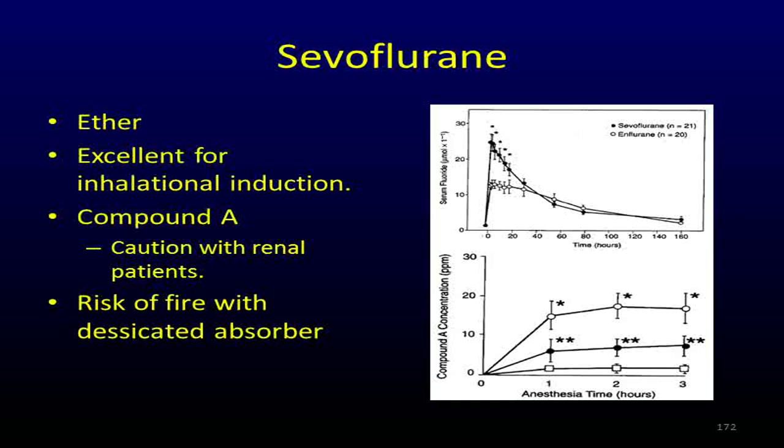Yes? I understand the combination with sevoflurane. How is it getting to patients? Because you breathe it in, so it's a close contact. You're using a semi-open or semi-closed system, because what you don't know yet is that the pressure valve on your circuit will dictate how much of it you open up to the patient and how much of it you keep closed to the patient. But you haven't learned that yet.